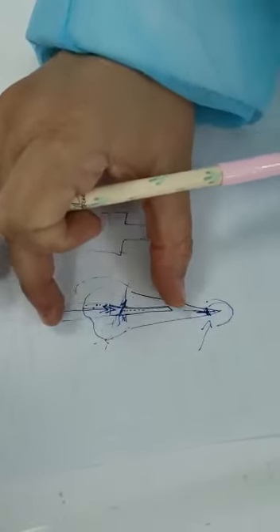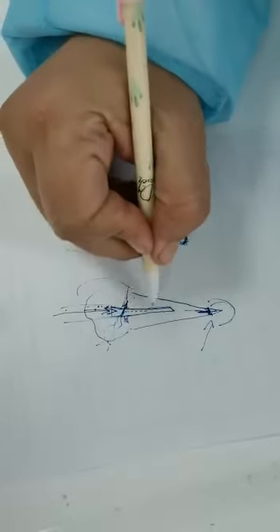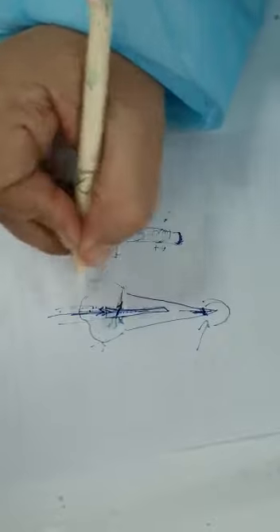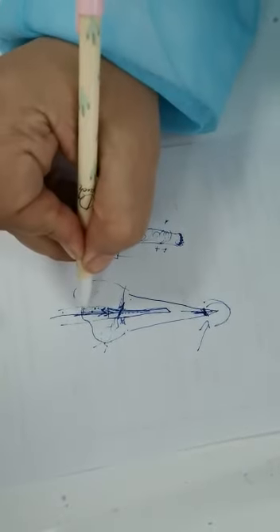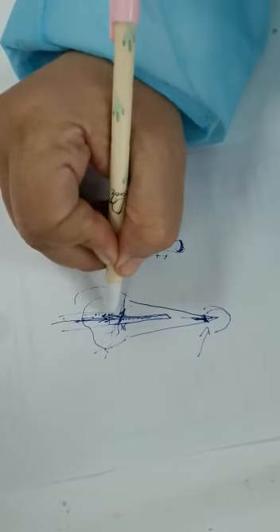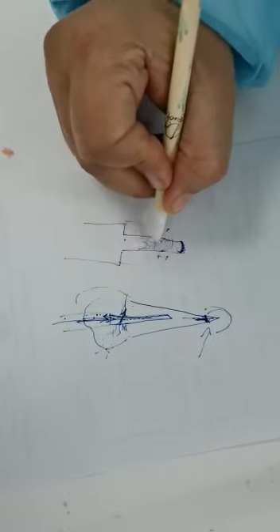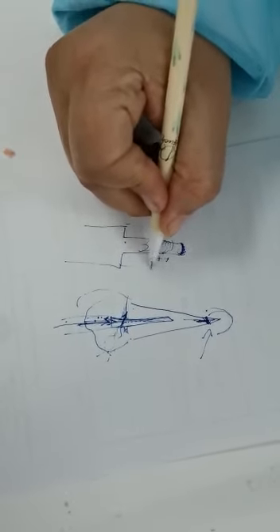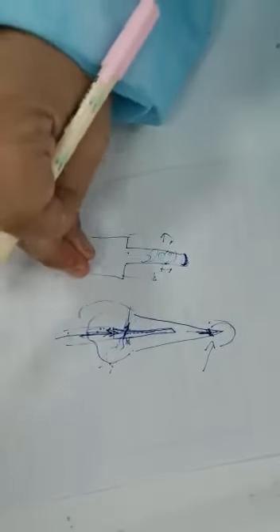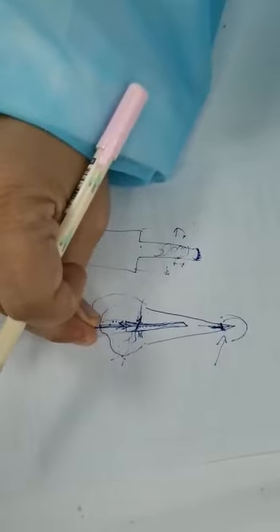They come specific to specific post systems. They come with the same system, because we know some of the post systems have metal inside. So every company observes if it has a metal core inside the post itself or it doesn't. Okay, and it manages to go in the root centrally without touching the side dentine here and the side dentine here. It has a safe side to it, so you use the specific removing burr specific to the case. But if you don't have that burr, you refer it to endo and you remove it using the microscope.